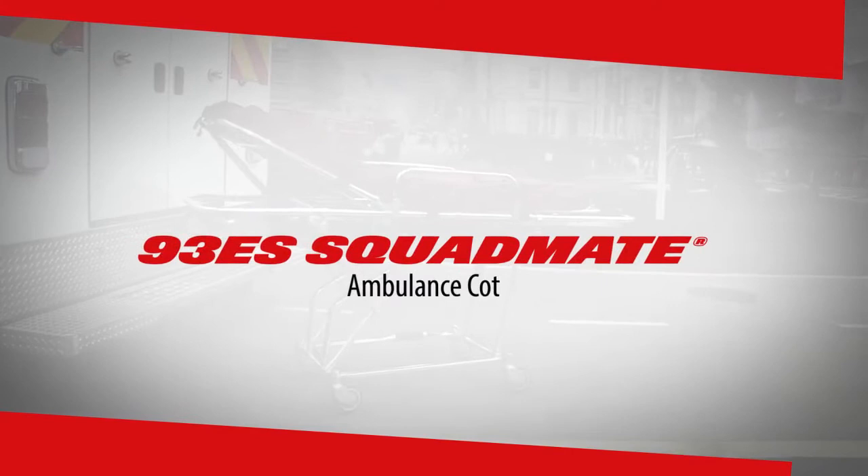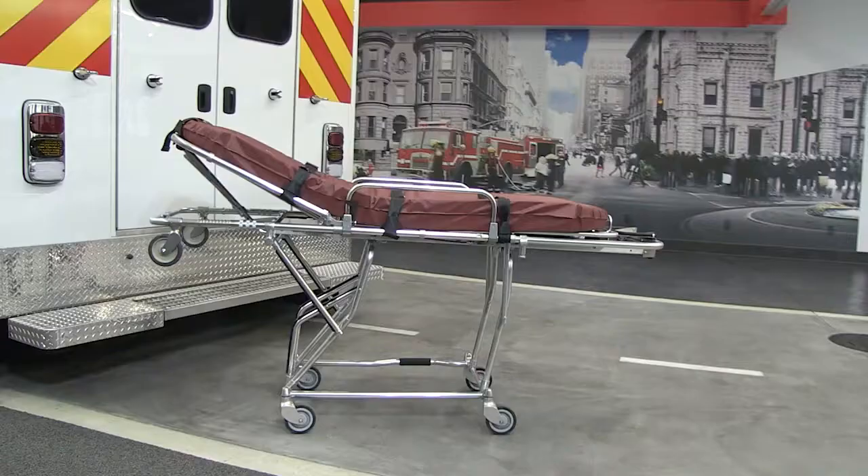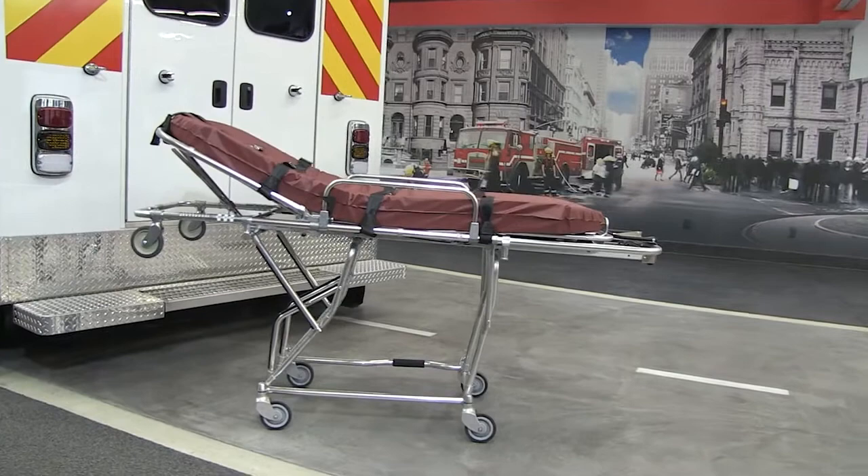Thank you for choosing the FERNO 93ES Squad Mate. This video will familiarize you with proper operation and maintenance of the cot.